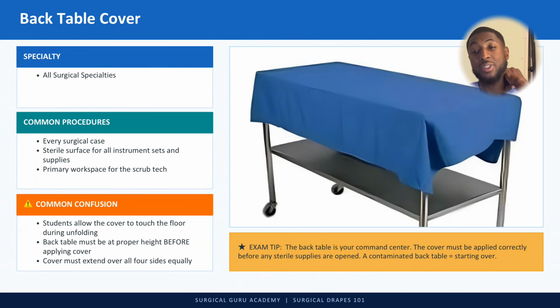And I guess that applies for tables that can adjust, that can go up and down. And the cover must extend over all four sides equally. Okay, so you want to make sure it's even.